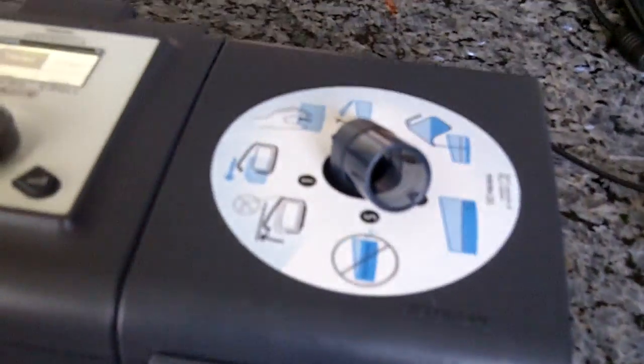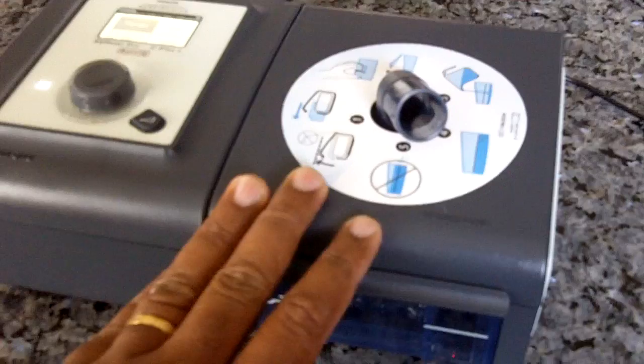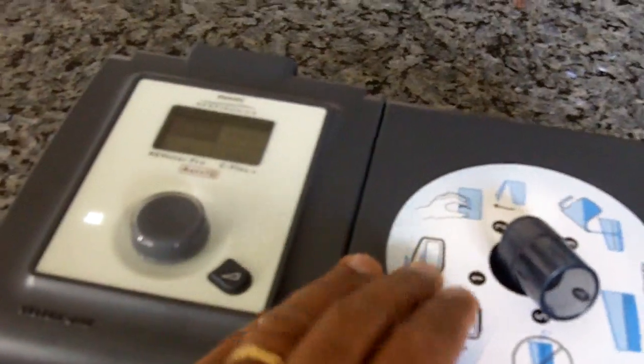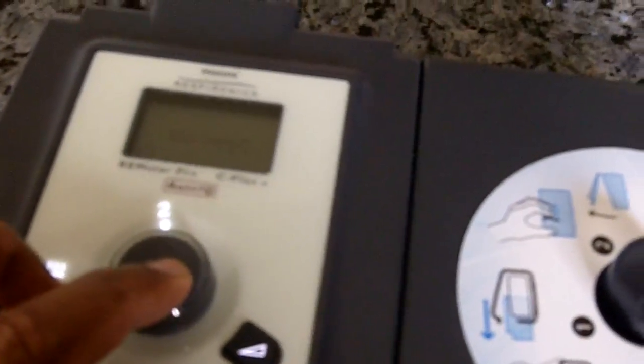So this is where you can begin your preparation for bed. You can go brush your teeth, change to your pajamas, 15-20 minutes later, jump into bed, put the mask on, and turn it on. You're good to go. Okay? So this is a really, really powerful and useful feature, especially in the colder climates.